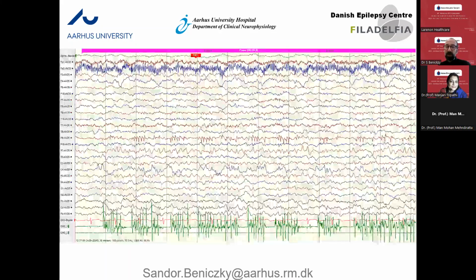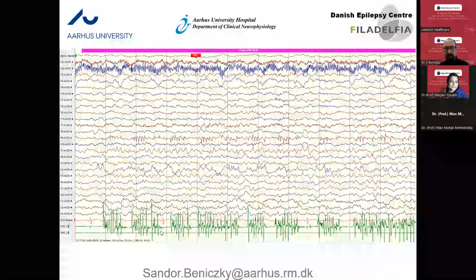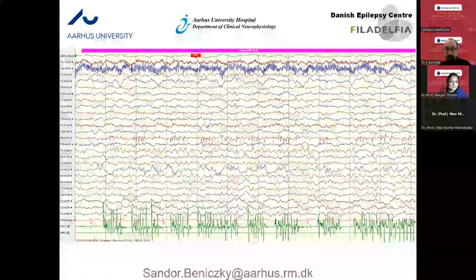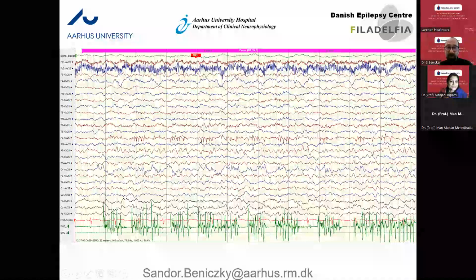And then this is the EEG that you see. It's in a common average montage, and the green channels on the bottom are EMG channels. Now, you see some delta activity here in C4. But honestly, this delta activity in itself, without clinical correlation, would be nothing. It would not be an ictal pattern. Yet, you can see that the jerk is time-locked to this delta activity. And if you don't have EMG, you could see the EMG artifact on the scalp EEG channel.